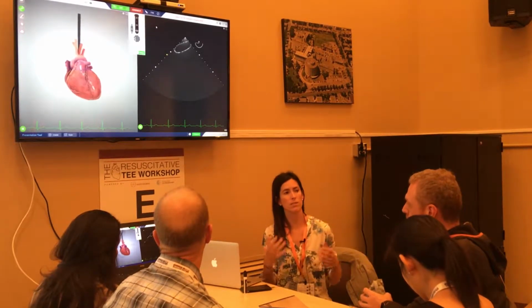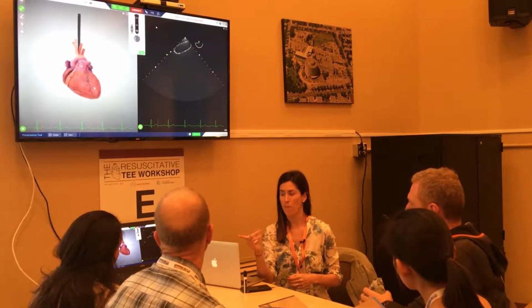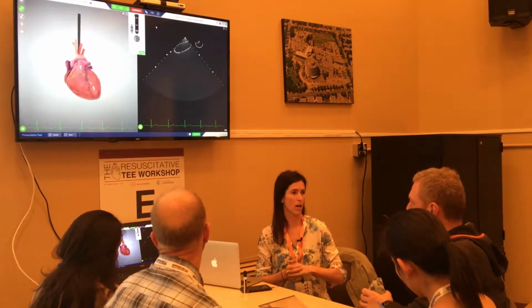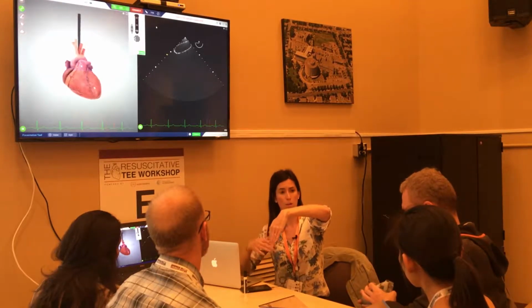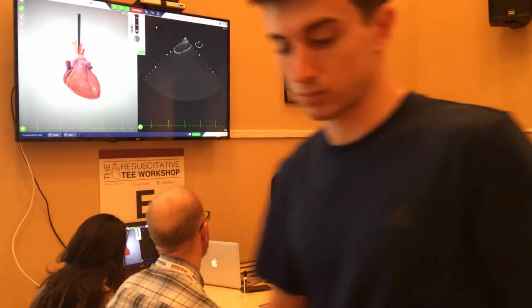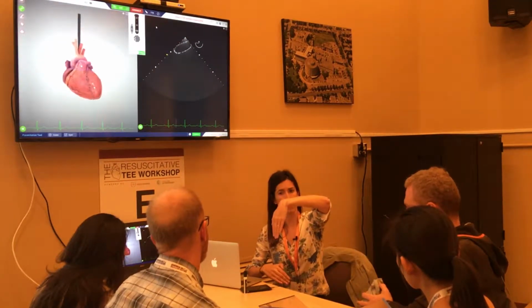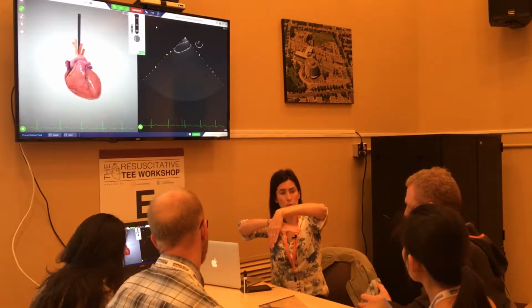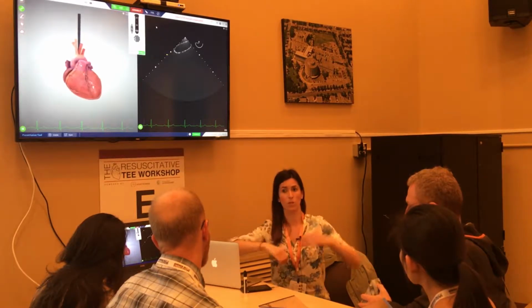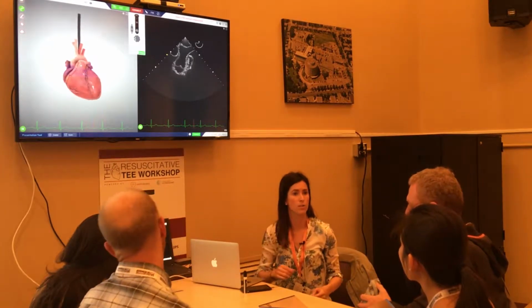Okay? What is the next major valve or vessel that we're going to see? Pulmonary artery, exactly. The pulmonic trunk. So think about that arch as a rainbow, okay? The pulmonic trunk will be cascading straight through underneath in its long axis, all right? The aortic valve and the pulmonic valve are perpendicular to one another, okay? So we're seeing that pulmonic valve in its long axis first. So we'll kind of dive down here, and you see that pulmonic valve coming straight underneath the arch.